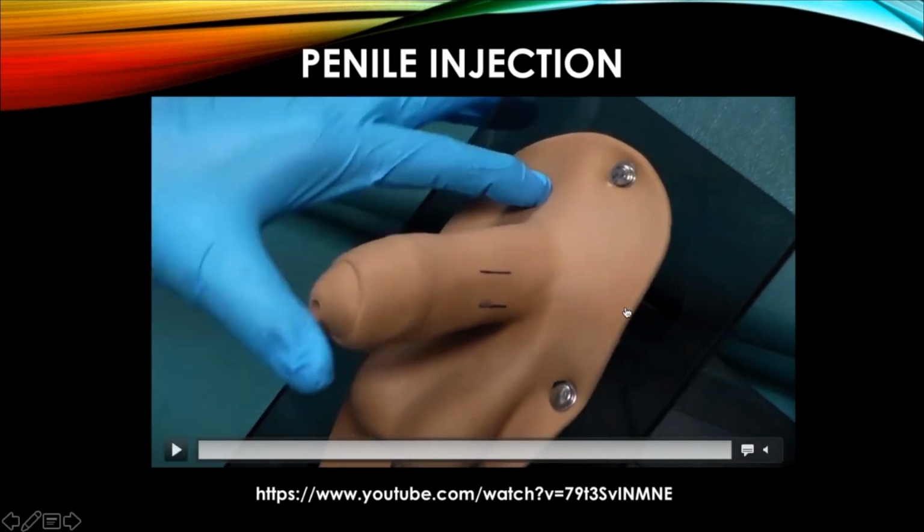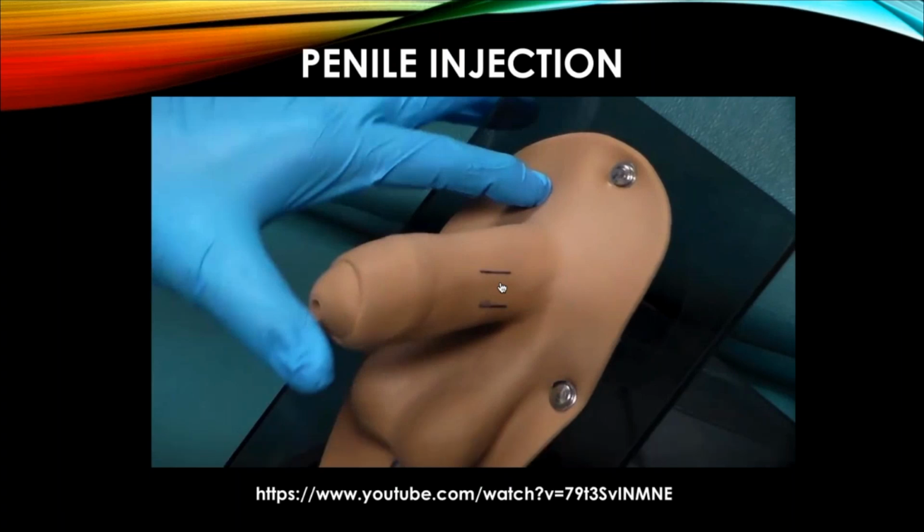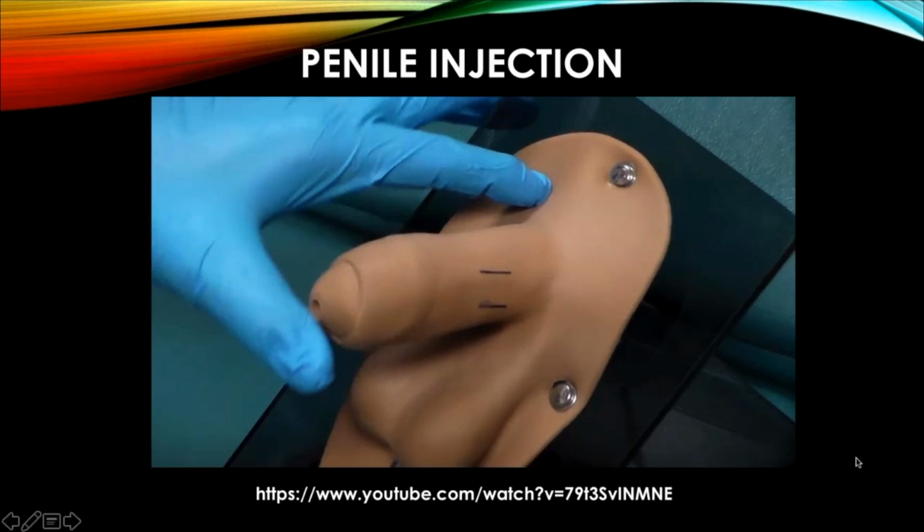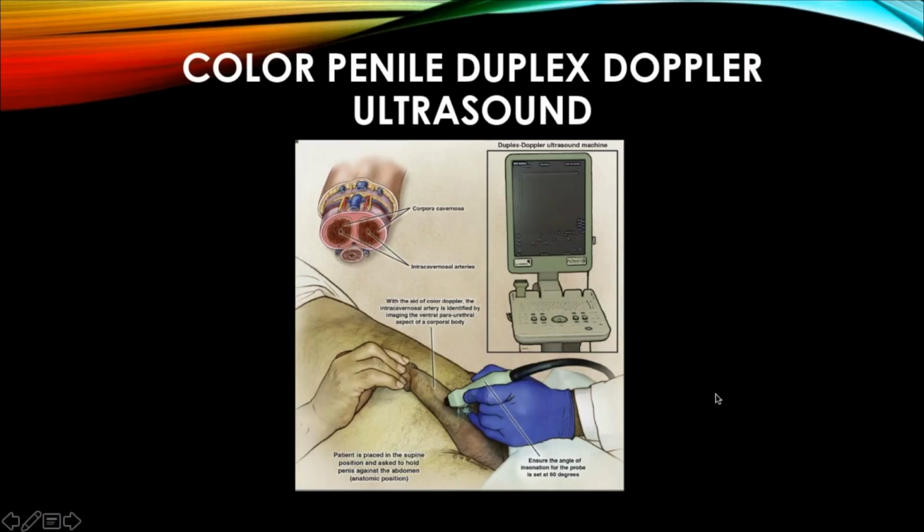Now, it's rare, but sometimes a doctor doing this doesn't get a response. Occasionally, you can inject into the septum. Some people will pull back on the plunger just to get a little withdrawal of blood, to make sure they're in the corporal chambers. And then the imaging will ensue.